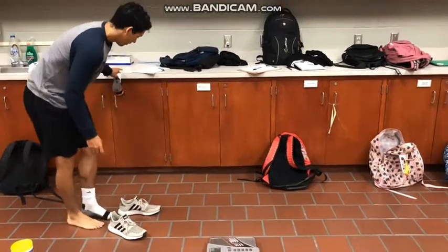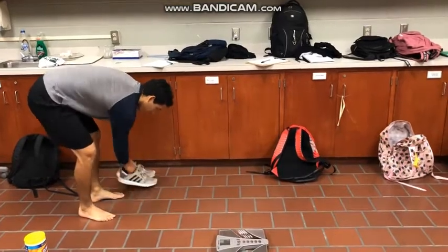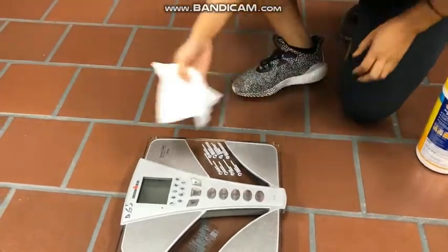The participant's body composition will be obtained through a digital scale. The participant will first be asked to remove their shoes and their socks, and the technician will disinfect the scale with a wipe.